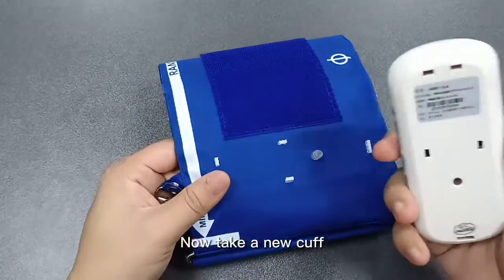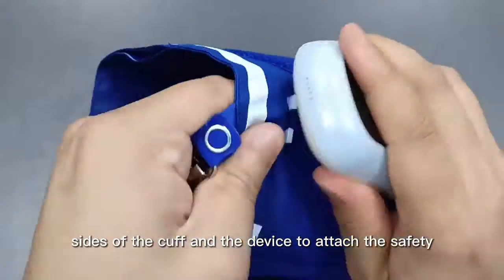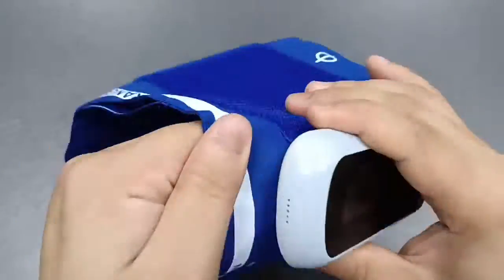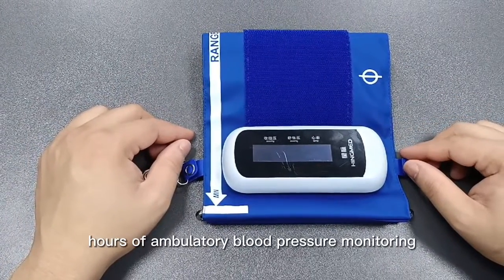Now take a new cuff. First, connect the cuff tube to the device. And press all the sides of the cuff and the device to attach the safety points of the cuff with the device. Now your device is ready again for 24 hours of Ambulatory Blood Pressure Monitoring.